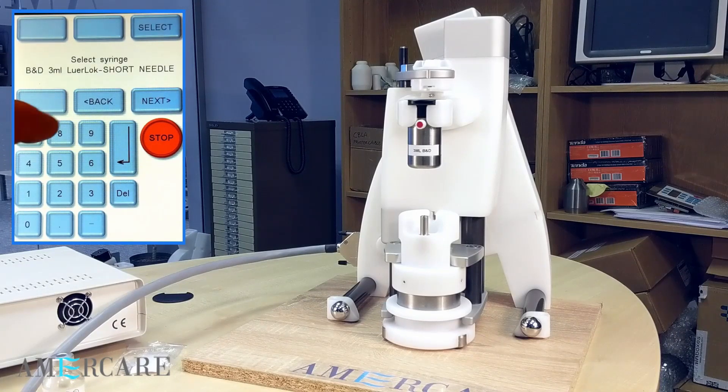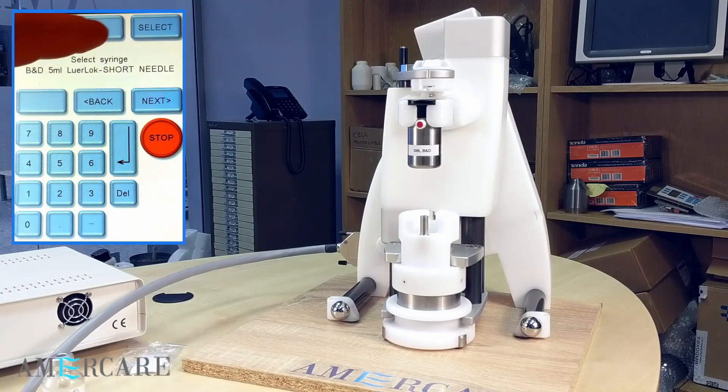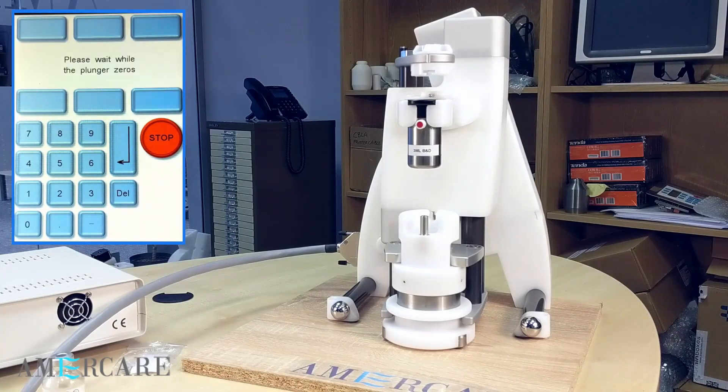Press back or next to move through the available syringes. Once the required syringe is shown, then press select. And the unit will now ask to confirm the changes.